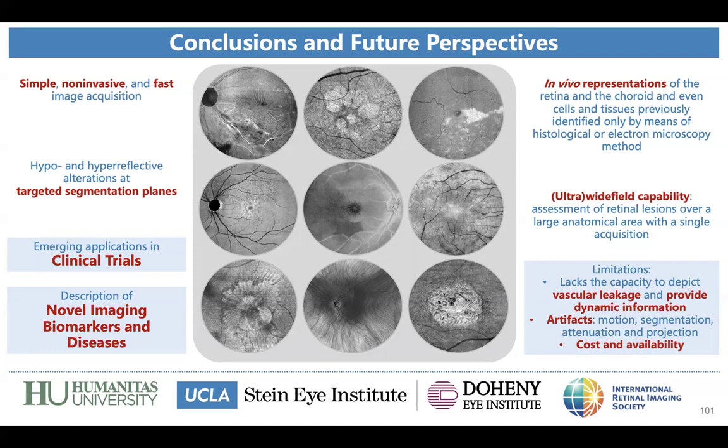It's also a fact of dependence. I get it. I totally agree. And en face is not built alone. You have the en face, you have the B scan, and maybe you have the OCTA together. So it's already multimodal. It's born like this. Exactly. Just one more question.